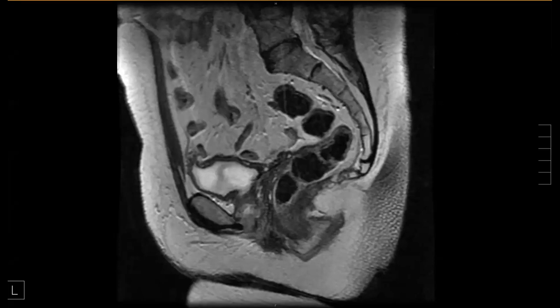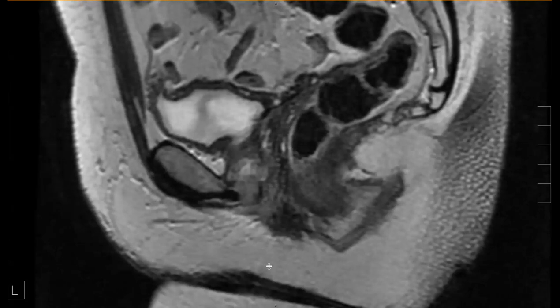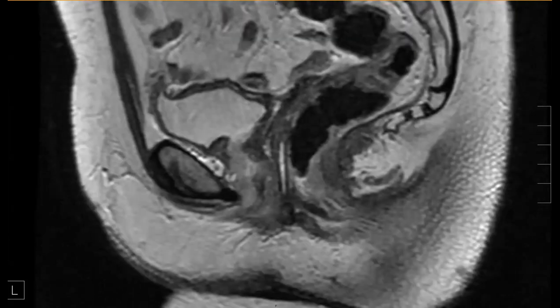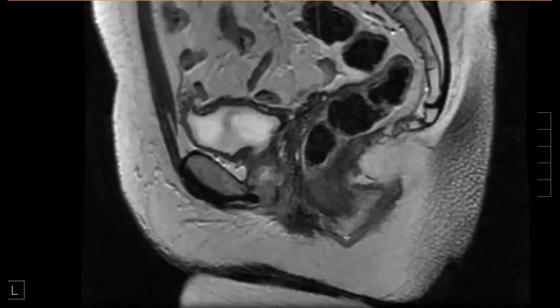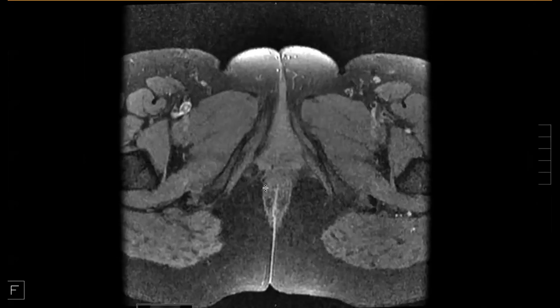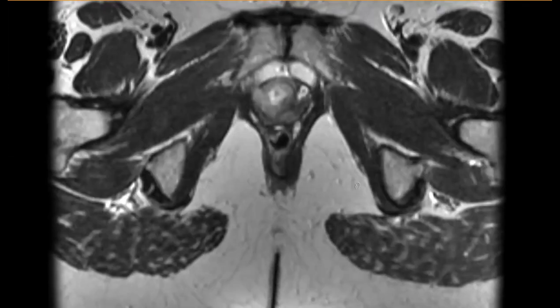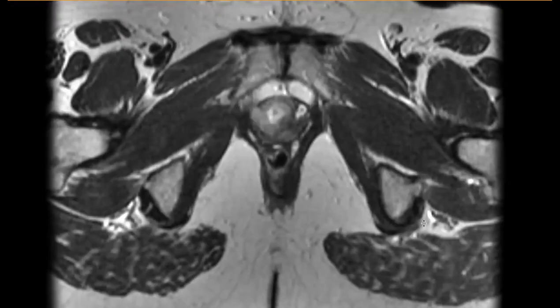This next patient — I'll withhold the history for now. Looking at the three compartments of the pelvis: the urethra is the anterior compartment, then the vagina in the middle — no uterus, so uterus is absent — and the posterior compartment is the rectum and anus. Residents, do you see anything abnormal? What do you think about the area of the urethra?